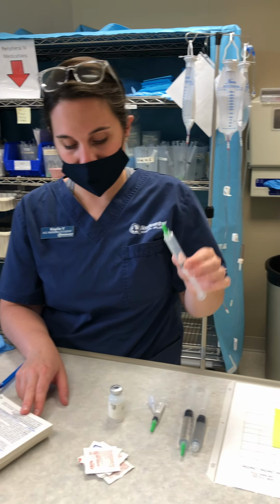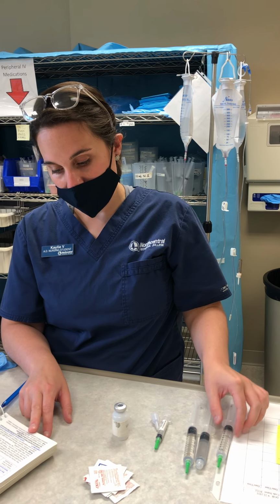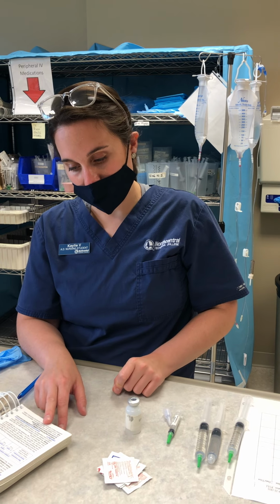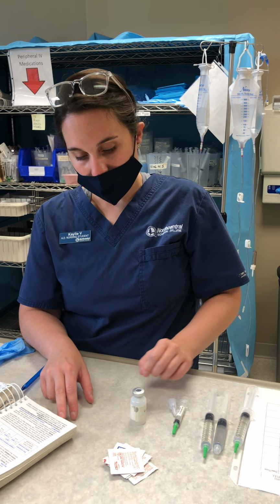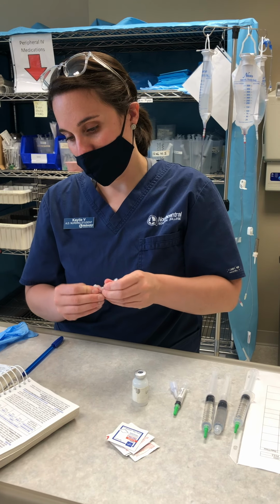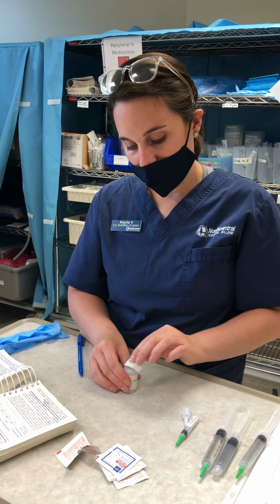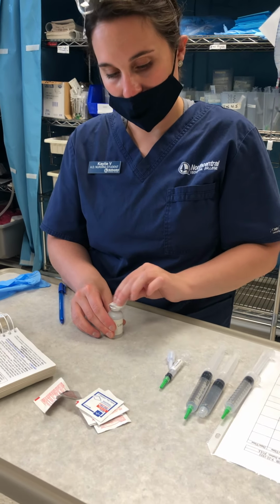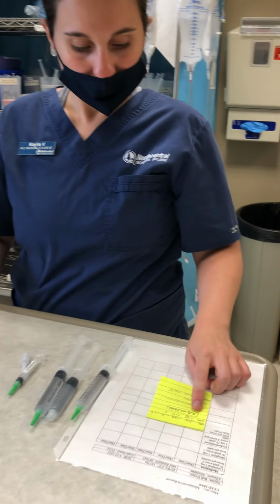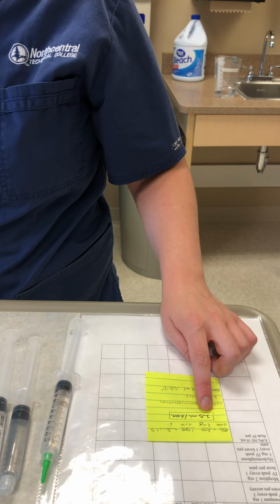I did check, lorazepam is compatible with normal saline, and it's to be administered over 1 to 5 minutes, so I'll be administering it over 1 minute today. And the first thing I'm going to do is draw up my dose, which I've already done my math right here, and it's going to come out to be 1.5 milliliters.